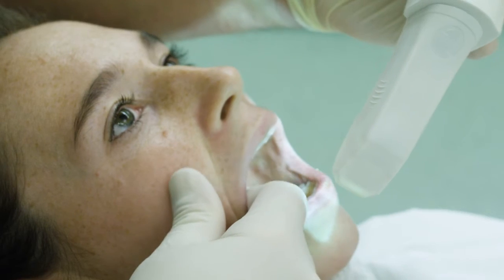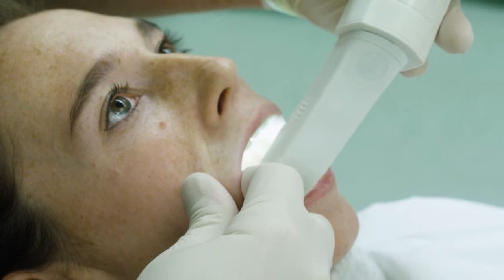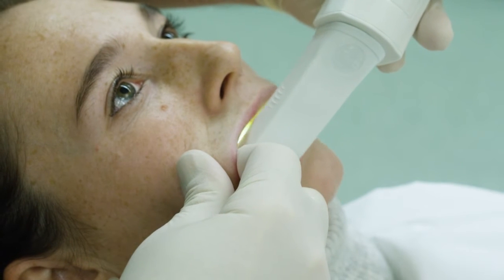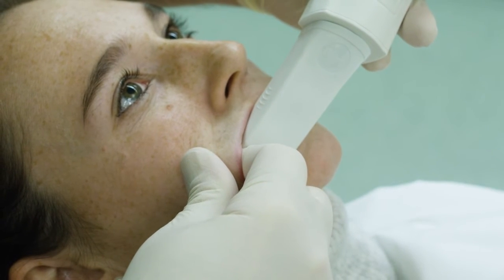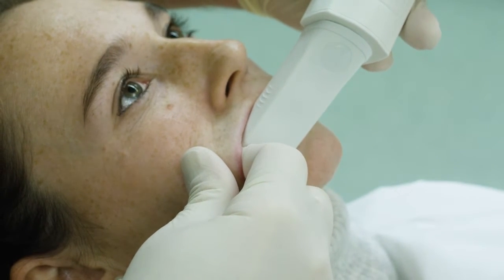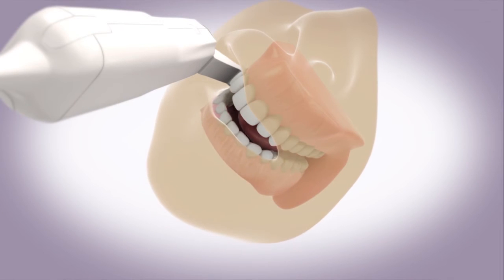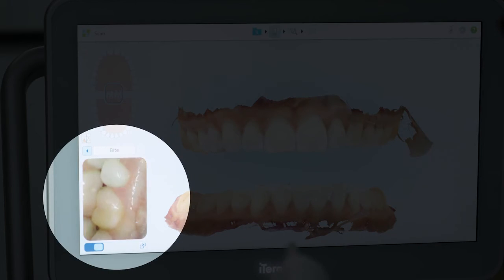To scan the bite, have the patient open, retract the cheek with the wand, and have the patient close in tight centric occlusion. Place the wand against the teeth and center the occlusion in the viewfinder.